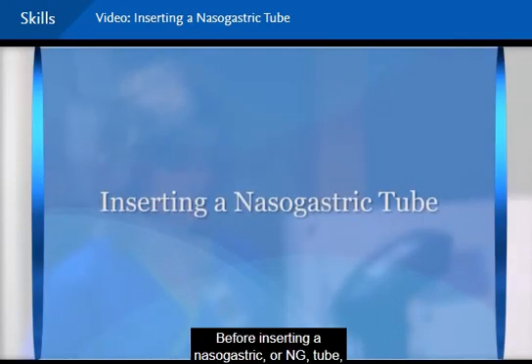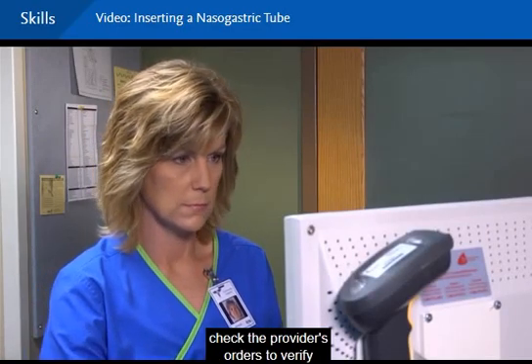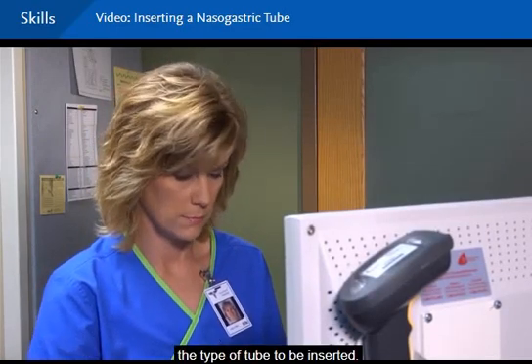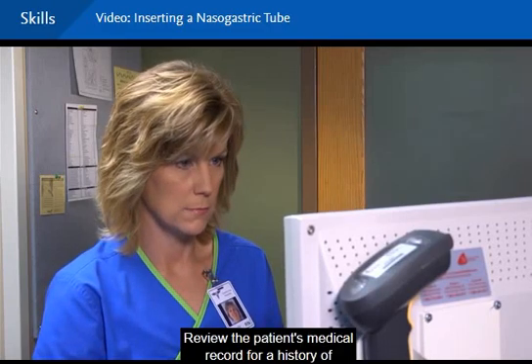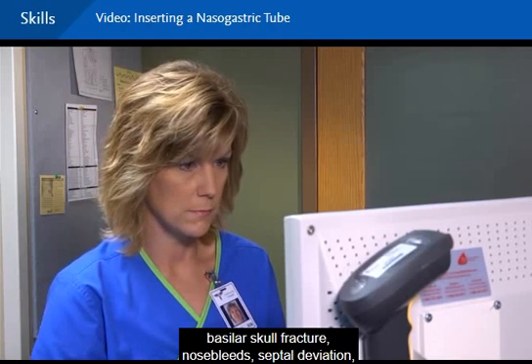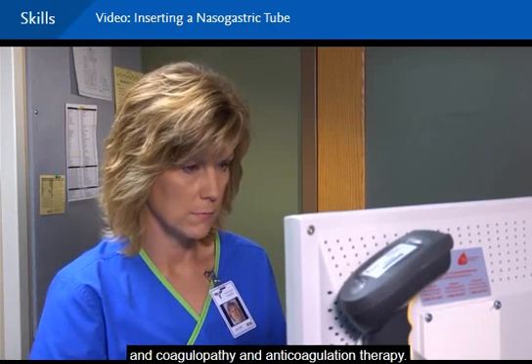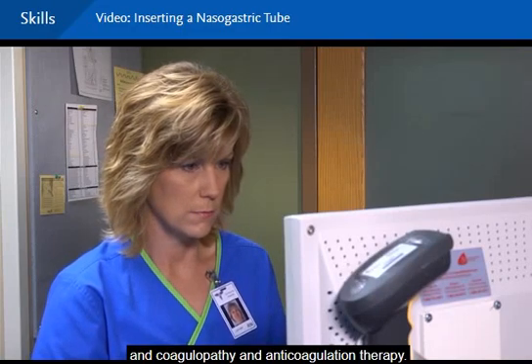Before inserting a nasogastric or NG tube, check the provider's orders to verify the type of tube to be inserted. Review the patient's medical record for a history of basilar skull fracture, nosebleeds, septal deviation, or other nasal problems, and coagulopathy and anticoagulation therapy.